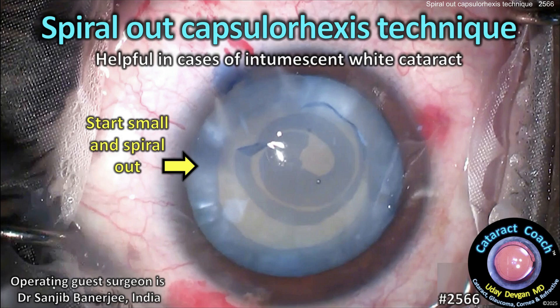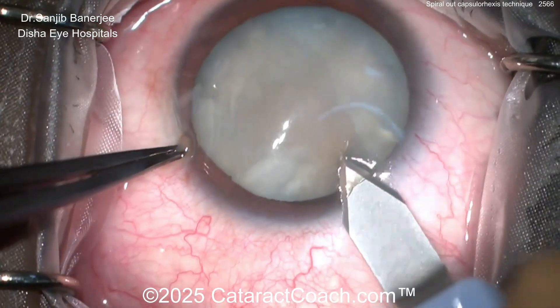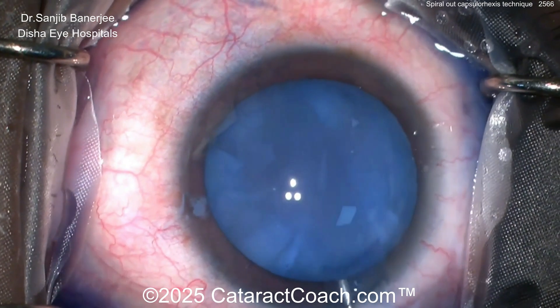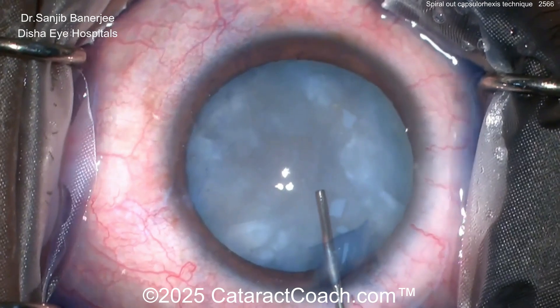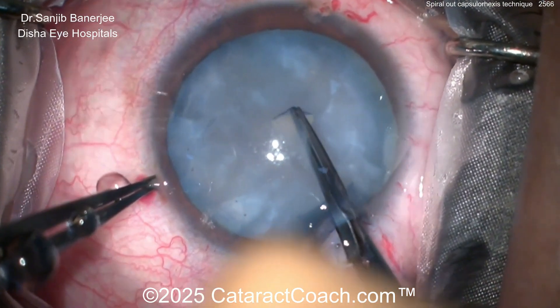cataractcoach.com — the spiral-out capsulorrhexis technique. This can be helpful in cases of an intumescent white cataract. The idea is you start with a very tiny baby rhexis. Here's a white cataract — making the phaco incision, putting a little trypan blue dye. Here comes the viscoelastic; try to flatten out that anterior lens capsule as much as you can. Now poking and starting that rhexis.